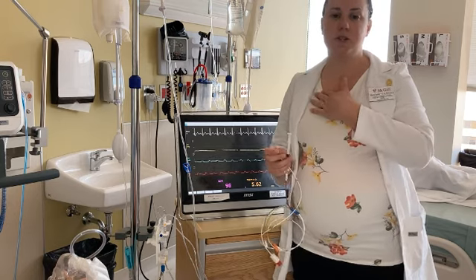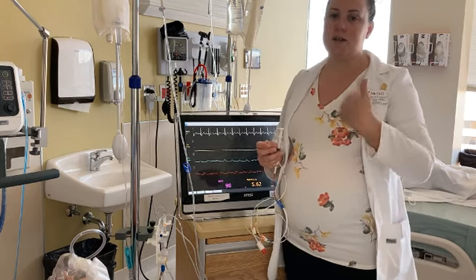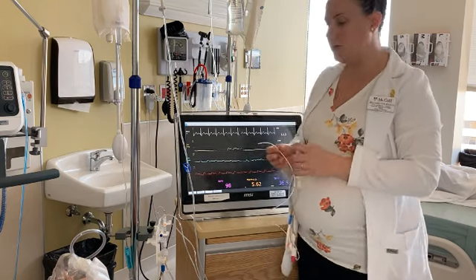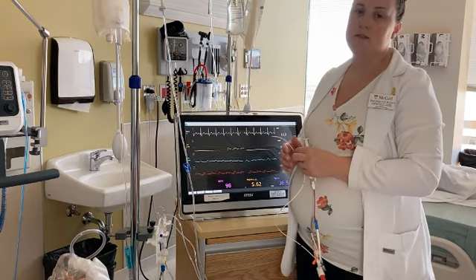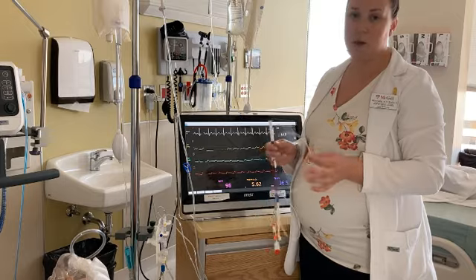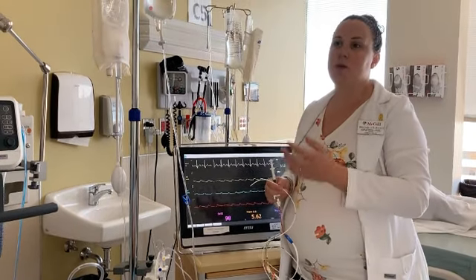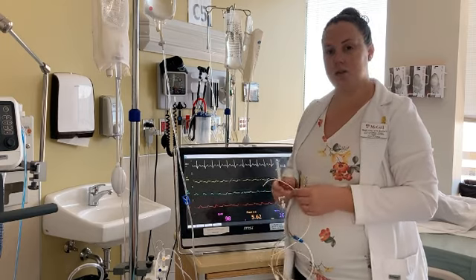So similarly to the central venous pressure or the right atrial pressure, it really gives us an idea of the left atrial pressure, and so we would use this wedge pressure as that number to help us to see if there's any significant differences between right-sided function and left-sided function of our heart.